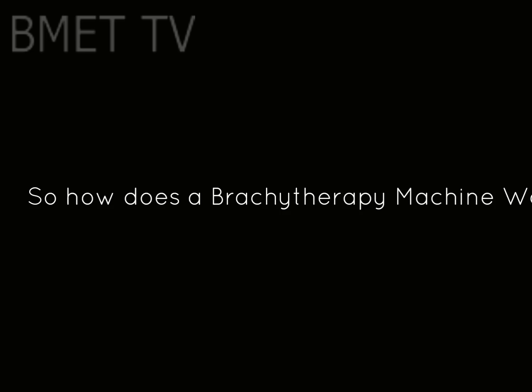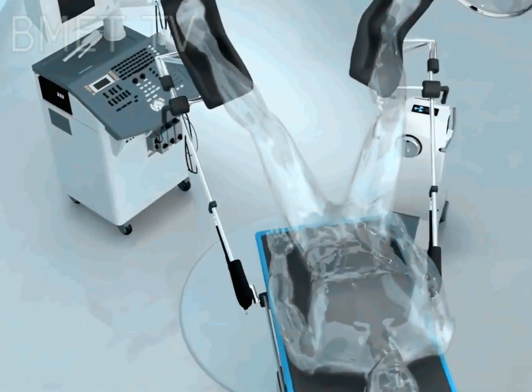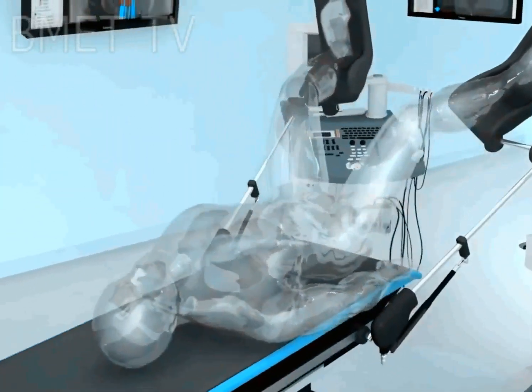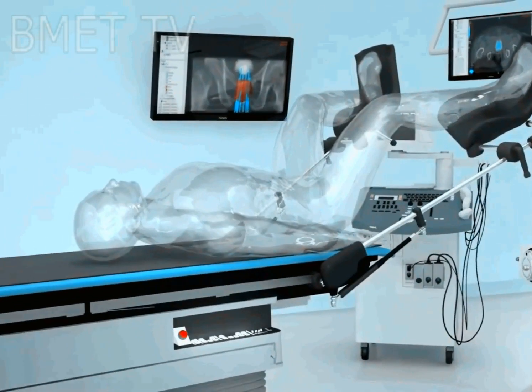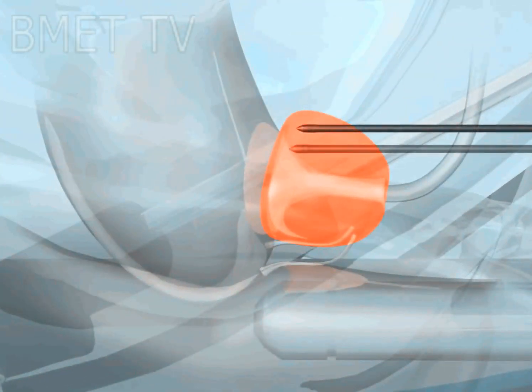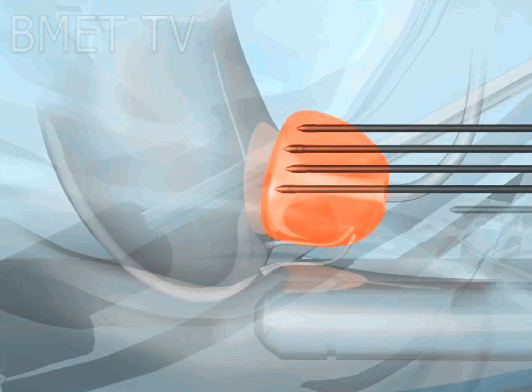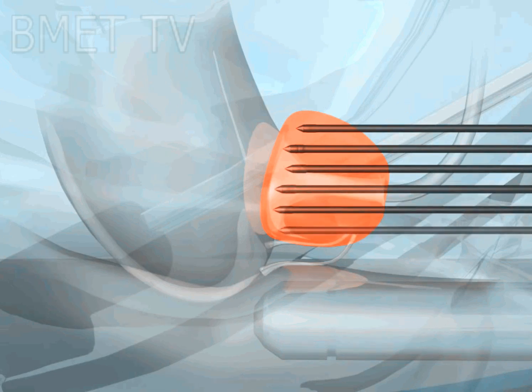So how does a brachytherapy machine work, and what are the components of a brachytherapy machine? Brachytherapy is a form of radiation therapy used to treat various cancers. Treatment involves surgically placing radioactive seeds, capsules, or other implants directly in or near the cancerous tumor. The implants give off radiation for a short time. Radiation from brachytherapy targets cancerous tissue, sparing healthy surrounding tissue. Brachytherapy is also called internal radiation therapy.